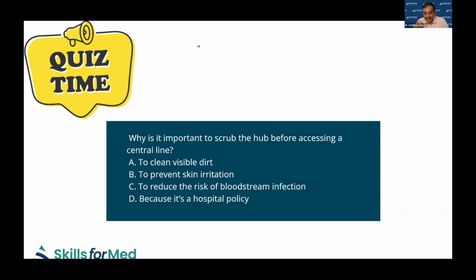So there was a study where they cleaned these hubs with alcohol for varying seconds. They found if you do it for 5 seconds, still the bugs were there. At 10 seconds, very few. But from 15 seconds onwards, there was not even a single bacterial spore on that hub. So this is the reason why it is done for 15 seconds. Now you understand why it is so important.